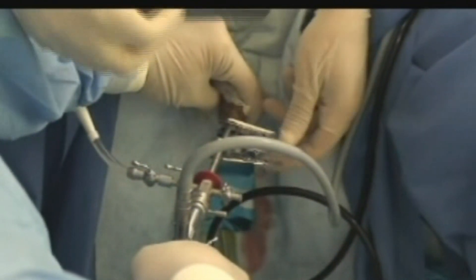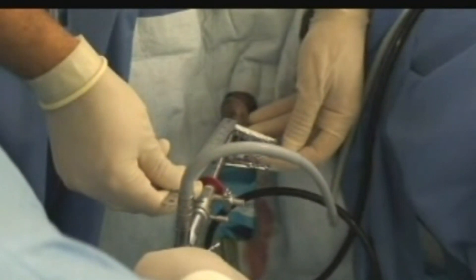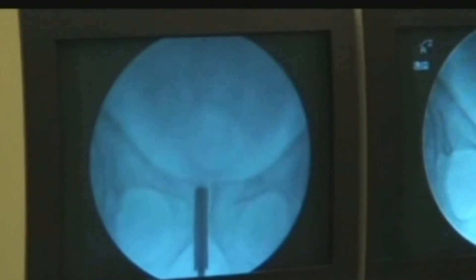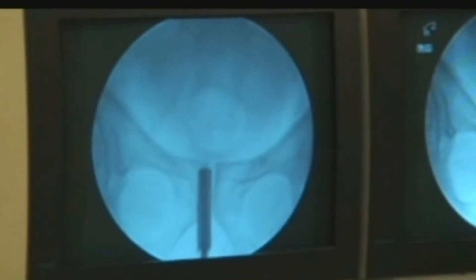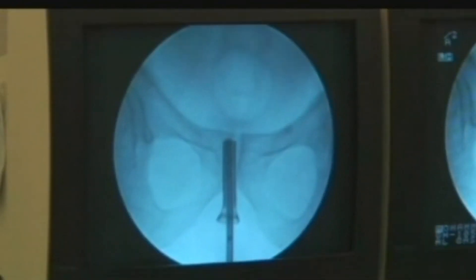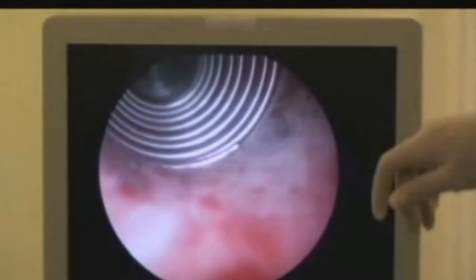For this kind of stent, we have to take measurements to choose the length of the stent. Then, under vision and fluoroscopy guidance, we place it and inject hot saline above 50 degrees centigrade, so the lower part will be inflated and the stent will be kept in place.